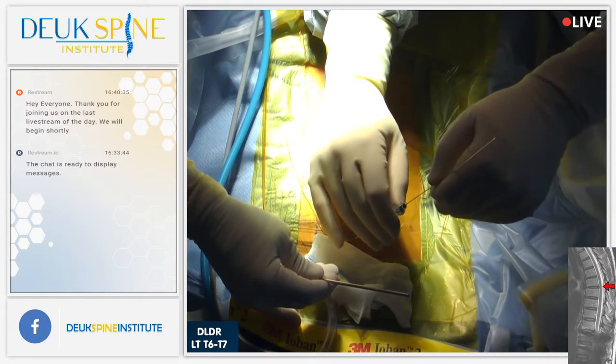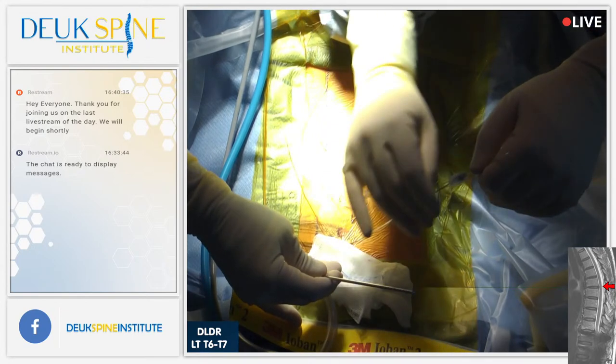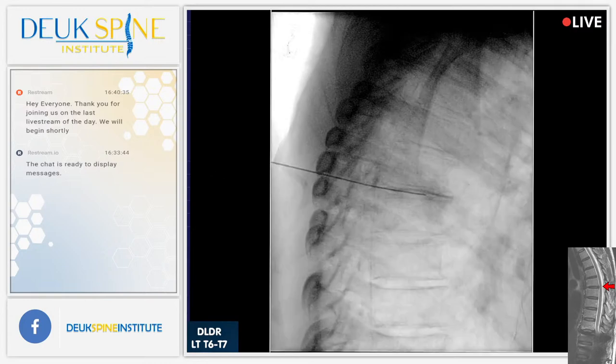You see the guide wire? Show them the guide wire in the disc. Careful not to pull your guide wire out. There you go, you see that, Henry? Yes, we do. All right, now we're going to bring this dilator. Check this out, folks. Let me have the tube.